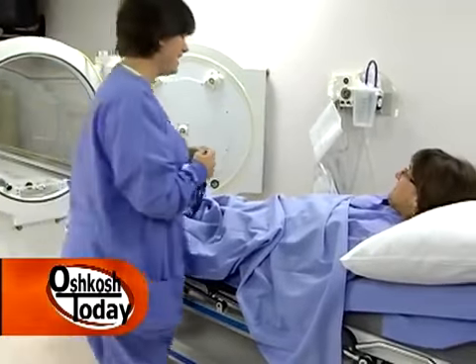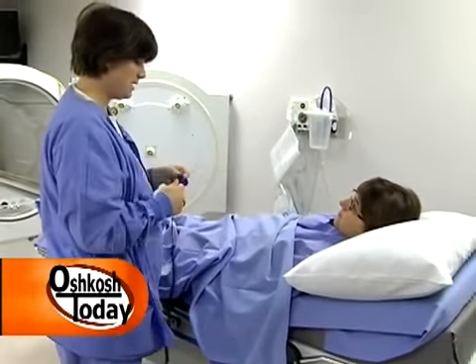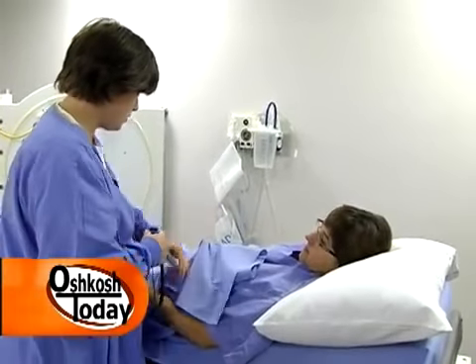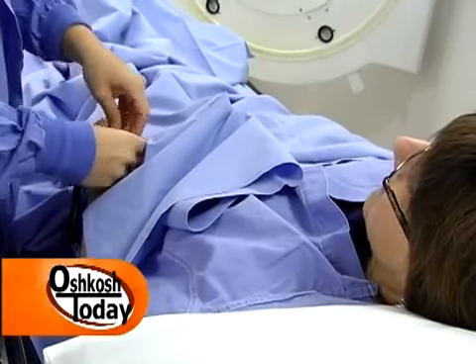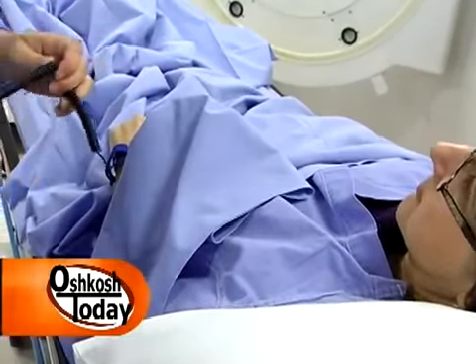Okay, so if you have something like that, do you have to prepare yourself, or is there anything you have to do before you come in for treatment? We will check the ears and the lungs before the patient goes into the chamber, and we will check to make sure that the eardrums are moving. Occasionally they're not, and people have to go to have tubes put in their ears before they go in the chamber. Before the patient goes in for therapy, we have to take their clothes off and make sure that they don't have any ignitable source, because they're going into a pure oxygen environment and it can be explosive. It can be dangerous. So make sure you don't have any of that with you. No lighters in there.